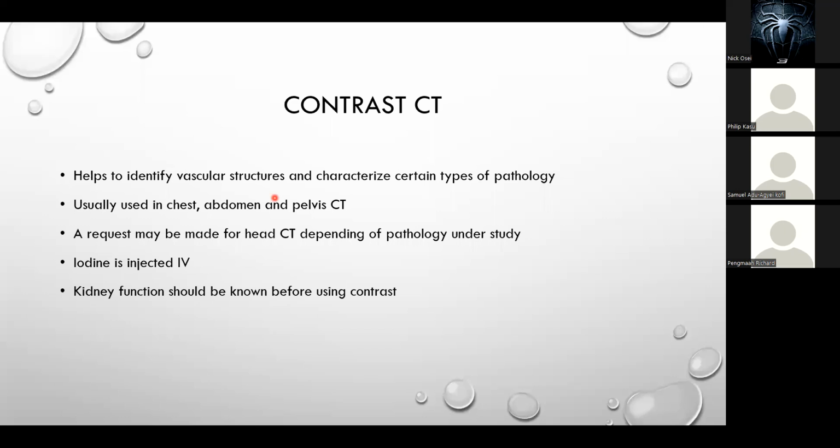And also we use it in the abdomen to delineate some of the structures like the kidneys, as I've said, and the pelvis when you're suspecting tumors and the rest. We use CT scan. It's very good in helping us know the extent of metastasis of pelvic malignancies.